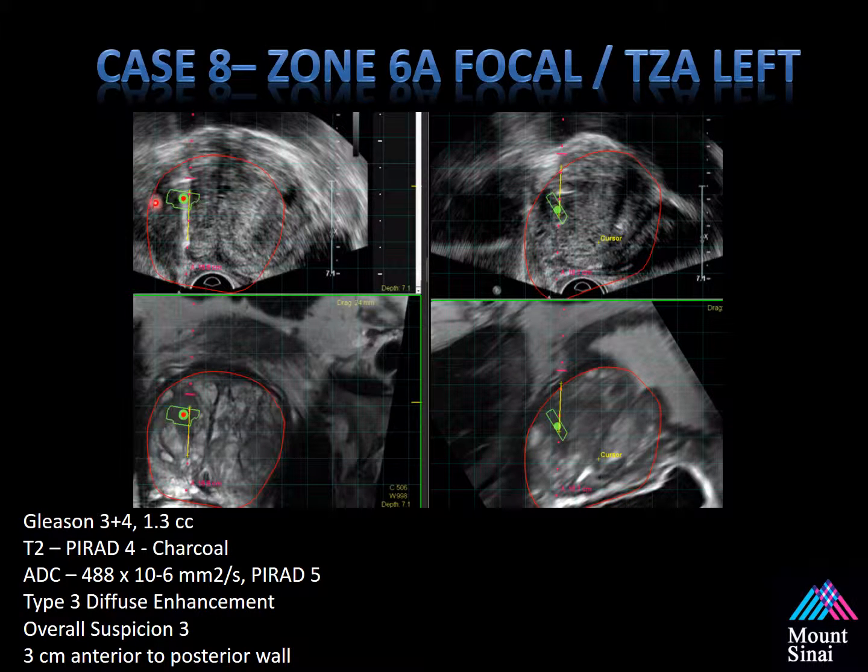This is the fusion biopsy. See the lesion? Each one of these markers is 1 centimeter. Therefore, you're not able to reach the top of the prostate to sample this under this traditional 12-core biopsy. See here, this is the segmentation on the ultrasound. Notice there's some indentation during the imaging. You need to be able to compensate during the procedure to be aware of what is changing to optimize your biopsy approach.